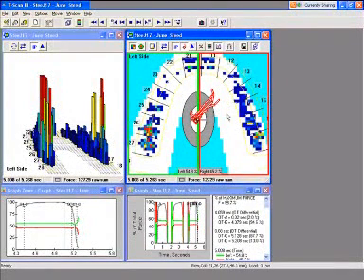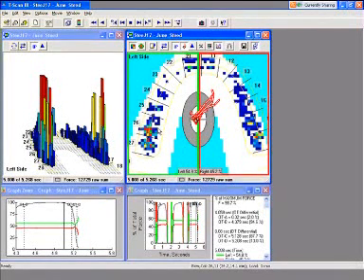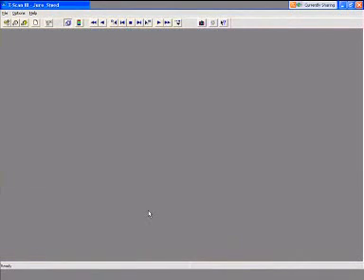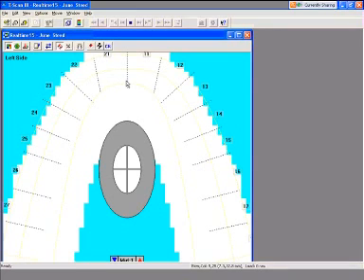It's really good information to show the patient that each consecutive time they're always heading in that direction. And every time those teeth come together, 2,000 times a day when they swallow, and if they're a bruxer, then we're really going to be in big trouble, there's an opportunity for breakdown, and that could be posing problems with what's going on with them. So you can also use the TScan to take lateral excursive movements. In fact, I'm going to do the next few movies without taking the handle out of my mouth so you can see how quickly you can gather the data.